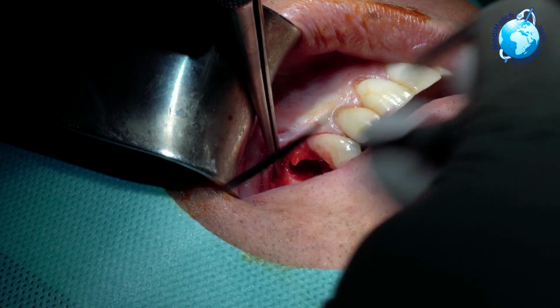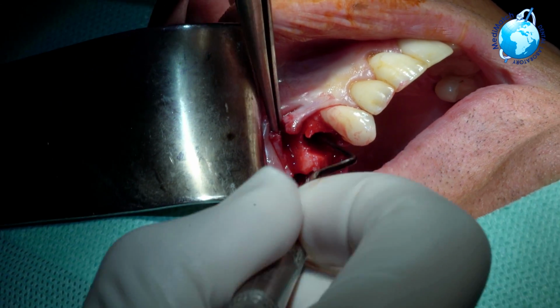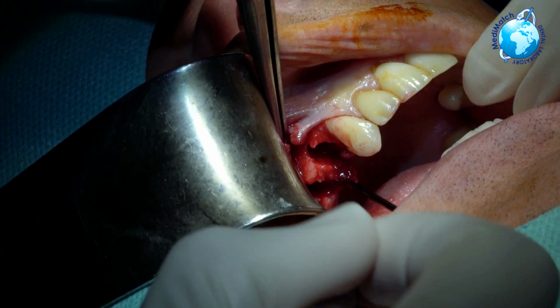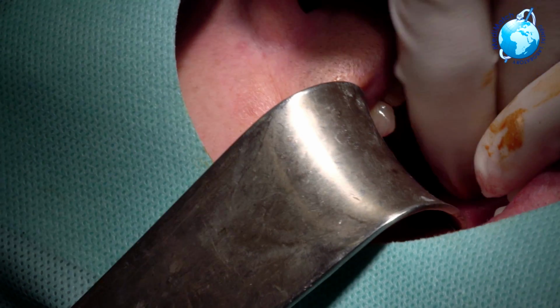Alan, if you could open a bit for me, buddy. How you doing? Yeah, good. Really good. Me too, I feel awesome. So we're just having a little feel, a little clean out of that socket. Going 2.8 straight, drill extender. Just get me my drill. Okay, bit more. That's it.